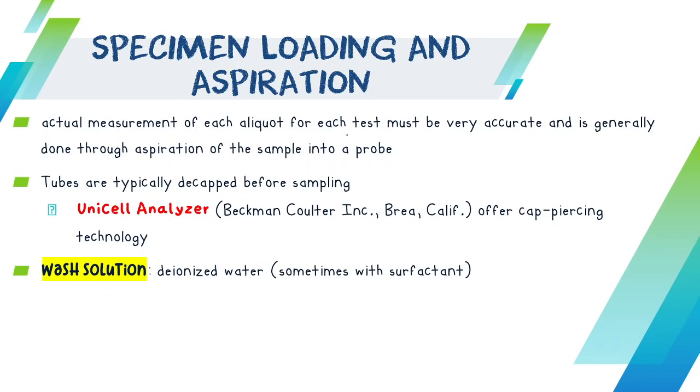Every after ang inyong probe mukuha og sample sa isa ka patient, ilhan man ang hugasan before na mo proceed na pud siya og kuha sa another sample sa next ninyo na patient, sa next ninyo na tube.